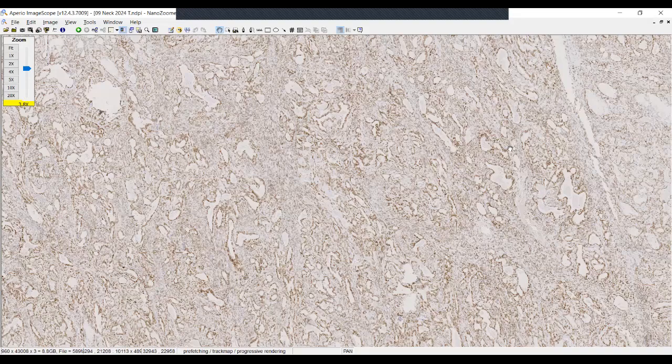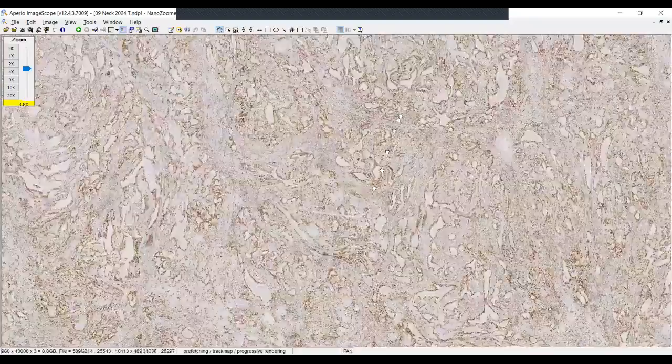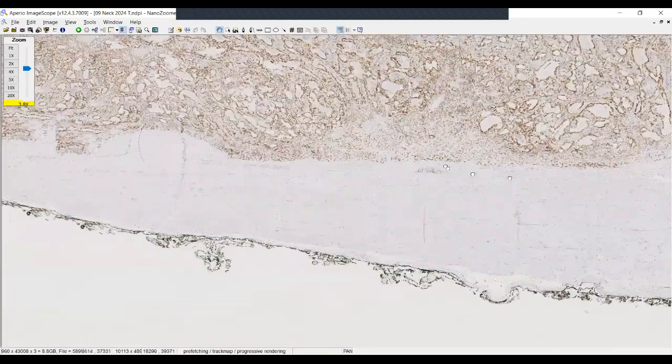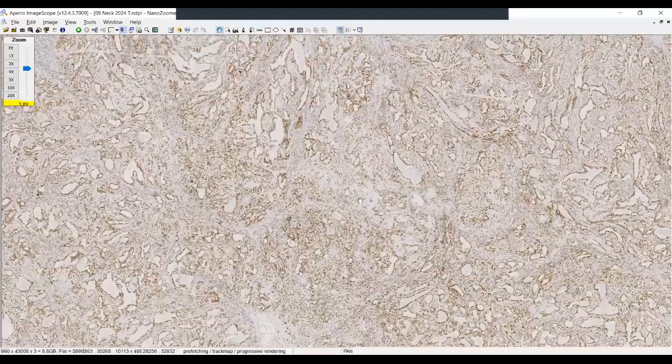Remember that neoplasms of the head and neck may often present within other organs, and in this case, I do think that it actually does compress the area of the adjacent thyroid, rather than arising from within the thyroid gland parenchyma itself. This marker clearly does illustrate that you would not have this present in thyroid, and therefore you can confirm the diagnosis in this example of synovial sarcoma. You could also do a FISH study for the characteristic SS18 or other marker if you chose to do that.